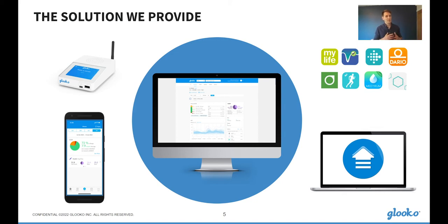So around the edge, we have the various different ways of getting data into the Glooko platform. In the top left, we have the Glooko transmitter. This would typically sit in clinic and allows for uploading a variety of different devices in a convenient way for clinicians. Below that, we have the Glooko smartphone app. This is primarily how patients would interact with the Glooko platform, and allows them to upload a whole range of devices via Bluetooth and NFC, as well as manually input various events.